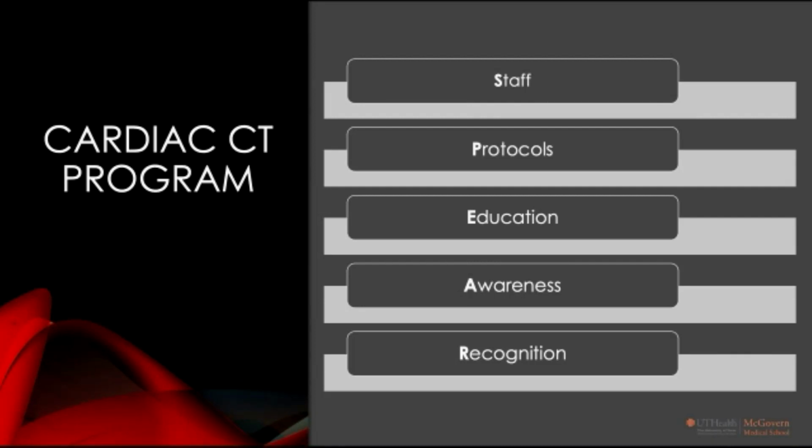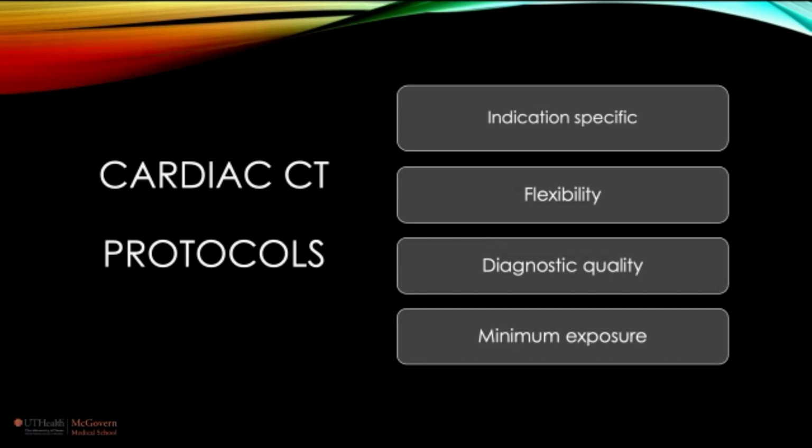Our protocols are important to delineate, and while every scanner will come with basic protocols, I think the addition of indication-specific protocols tailored to the needs of the particular community that we address is very important. We now have protocols which can address virtually any indication. We have protocols, including in our scanner, which address the requirements of specific clinical trials.